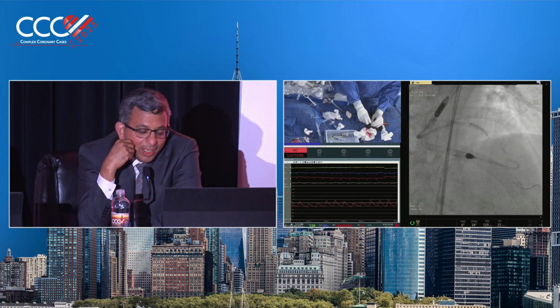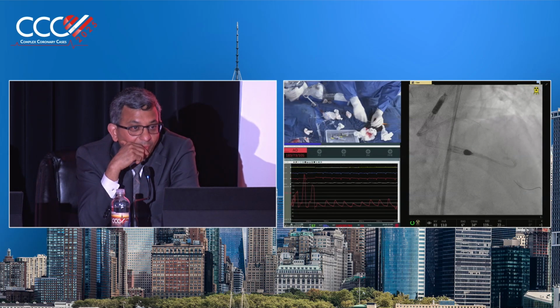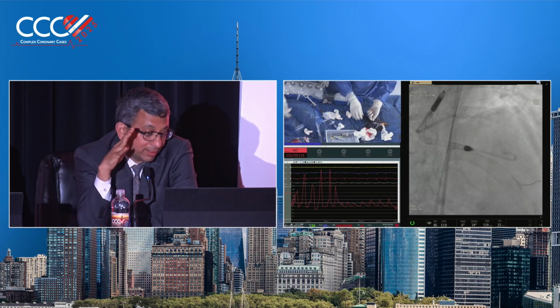Not really, Dr. Kapadia? We are still using it. I agree that it is financially very difficult, but still we are using it. We are not locking it up yet.